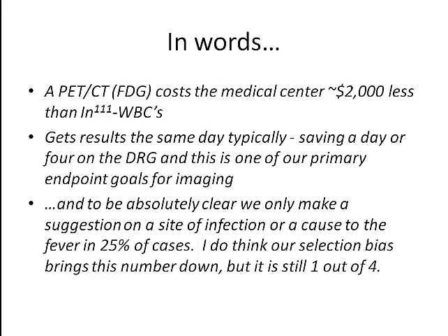So the primary impulse of imaging, and to be absolutely clear, we only make a suggestion of a site of infection or a cause of infection in 1 in 4 patients. So I don't want to say that this is a perfect imaging test. 75% of the time we don't help at all. But in that 25% of the time that we do, we're able to direct a biopsy. We're able to completely change patient management, which I think is pretty amazing.